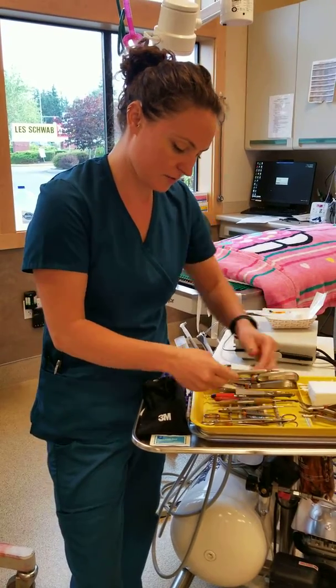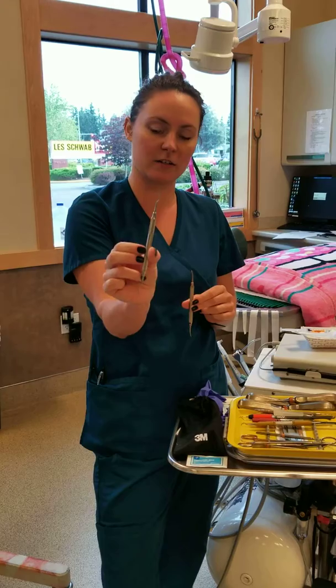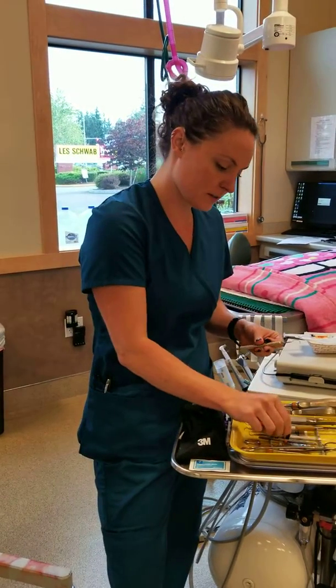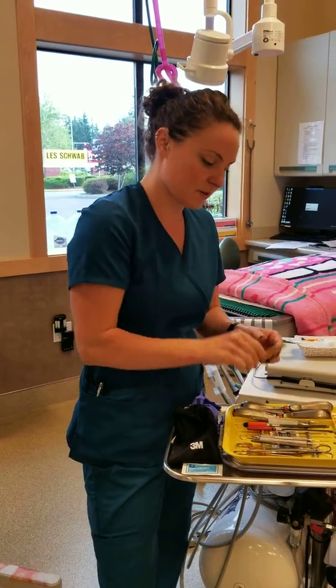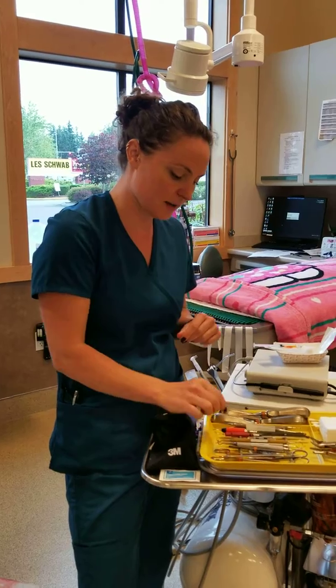Next we have two different sickle scalers. We have a straight sickle scaler here, and then we have a curved sickle scaler here — or hand scaler. We also have a curette. So those are our three hand scaling instruments in our packs.